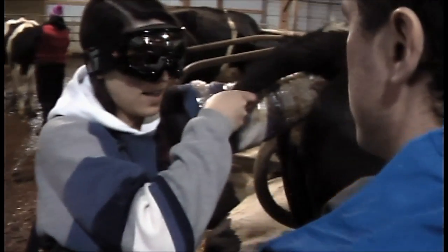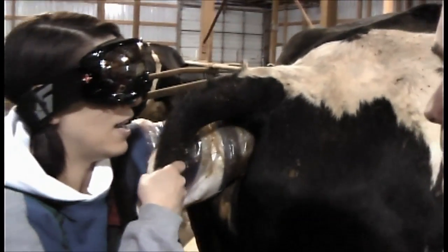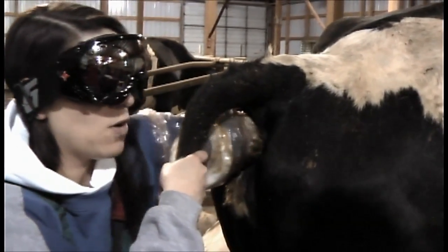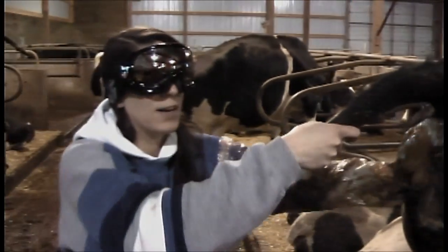This is a 28-day check. I can do 28-day checks with my ultrasound — it's not a problem at all. I see a nice looking calf in there. No abnormalities. Everything looks very normal. You'll have a nice calf in about eight months out of her.